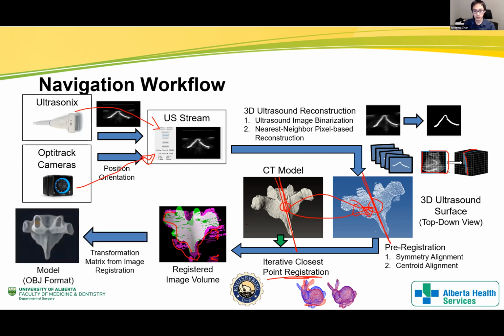Then we take all our transformation matrices from this registration process and apply it to a model so that we can actually display it on a screen.